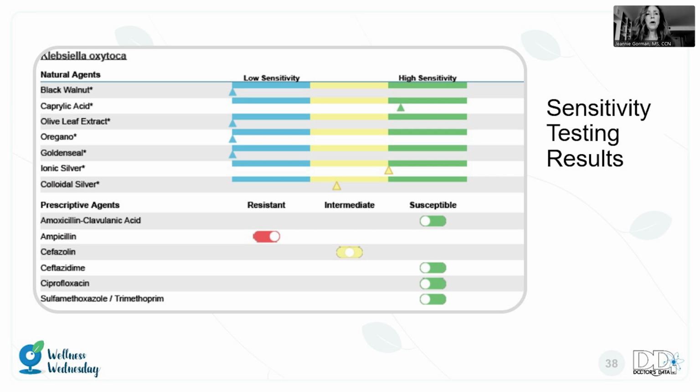At the end of the report, this is our cultures, but at the end of the report, once we get through the stool chemistries, we then offer you a page that looks like this if we have found any bacteria or yeast at dysbiotic levels. Dysbiotic level, 2+ or higher. Sometimes they're 3+ or higher based on the organism.